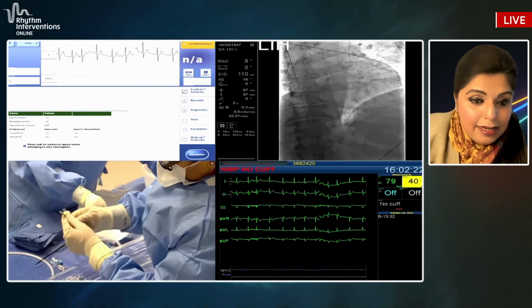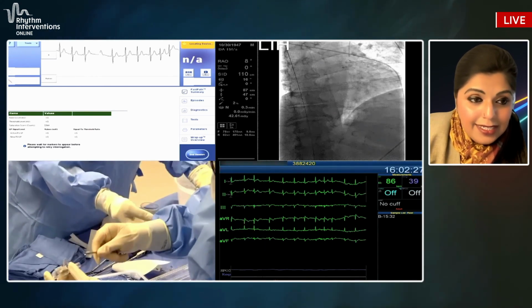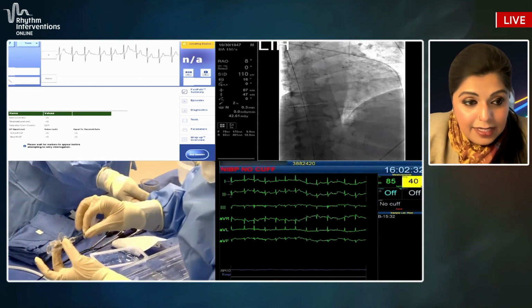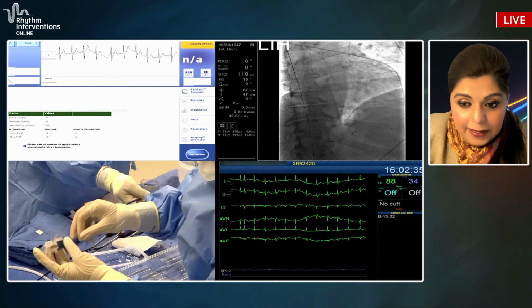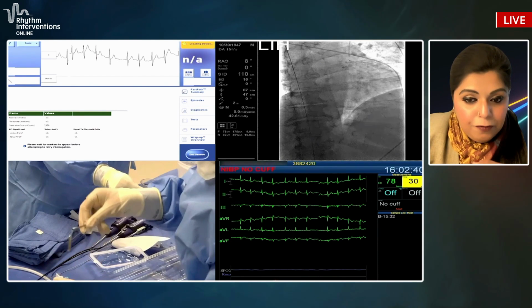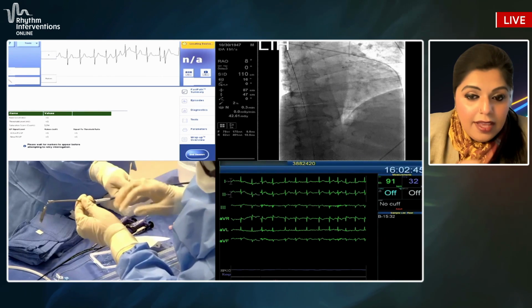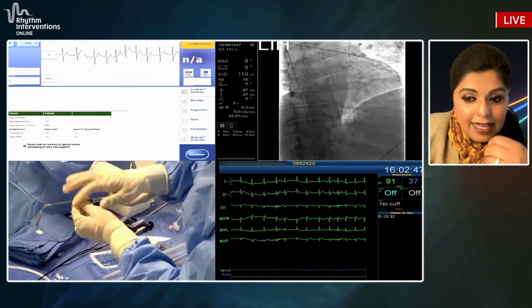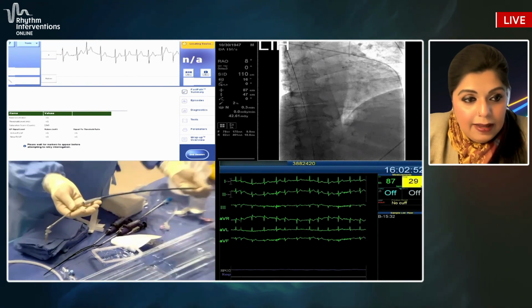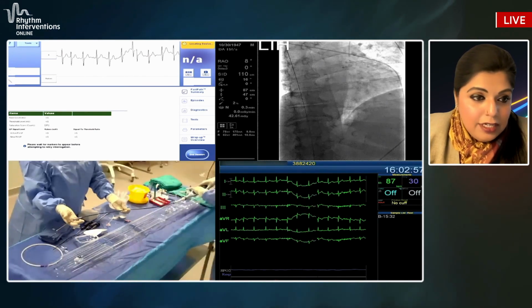What I'm looking at is the end of the delivery system, to make sure that my tethers are aligned. It's kind of hard to zoom in on that, but you'll have 2 tethers that you want to be aligned. You load those tethers into the funnel of the loading tool, and then you gently tug to confirm that it's very well loaded. You unlock, open, and remove the loading tool, and you let that device kind of hang. You don't want that helix to touch anything on the table, so you have your scrub hold it and let it just dangle down as you go back and dock it into place.